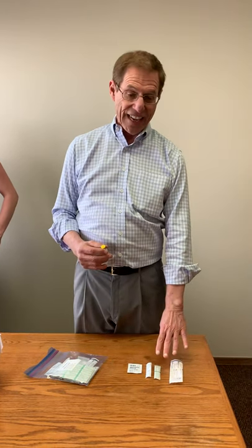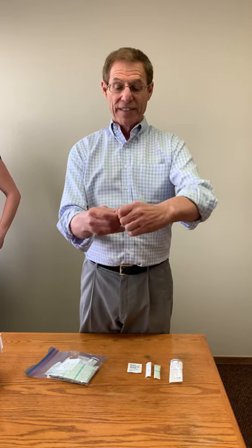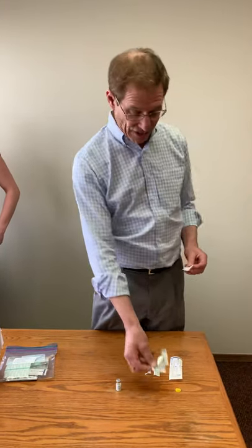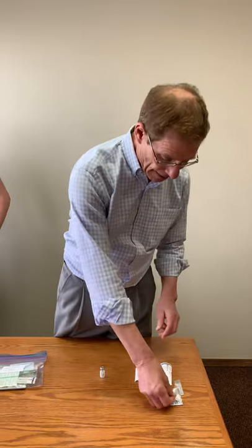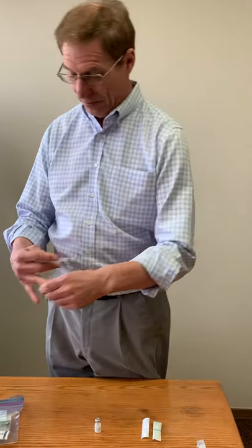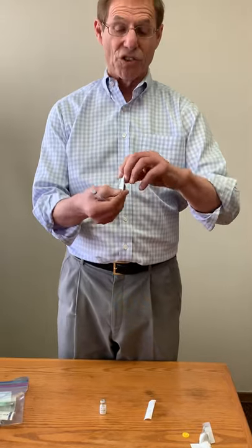Because it's thick, we use two different needles: a larger needle to take it out of the vial, and then a smaller needle to inject ourselves. We take the cap off, then use an alcohol prep — everything is in our little kit here with all the syringes and different sized needles — and we wipe off the top of the vial.